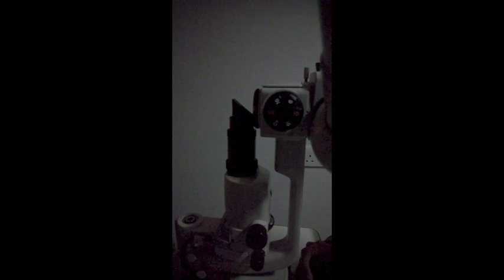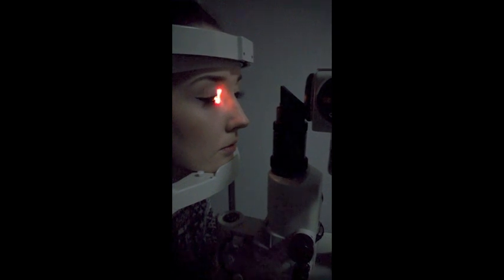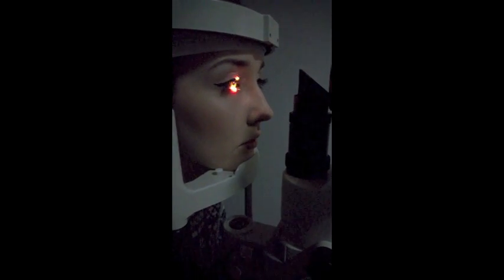With the patient set up, we can now begin. The illumination system should be put directly between the eyepieces, and you must instruct the patient to look at your ear. The slit lamp can then be turned on with the illumination on low.